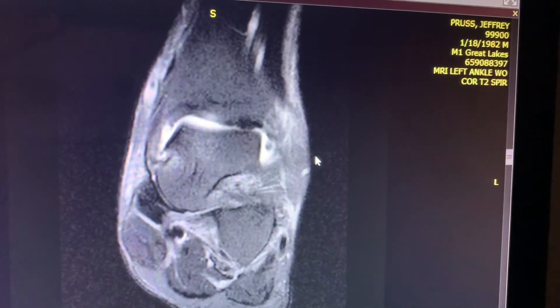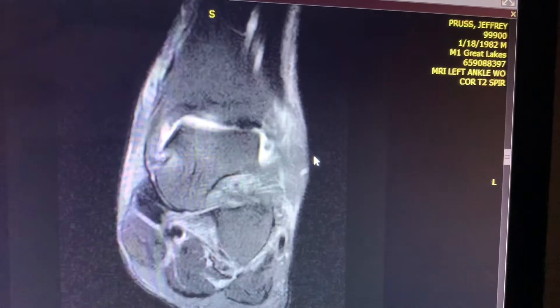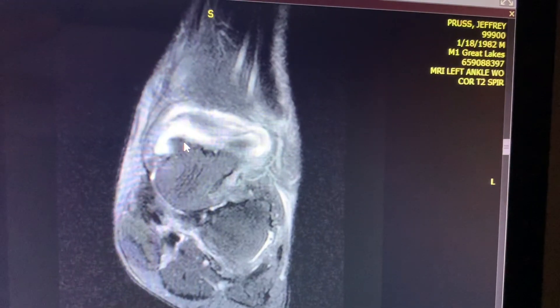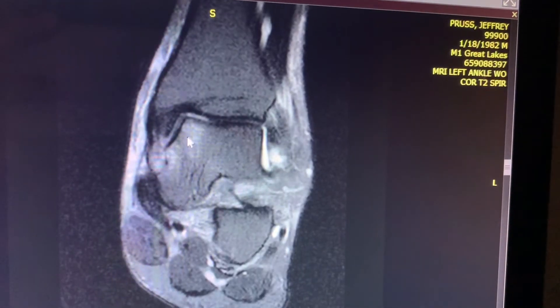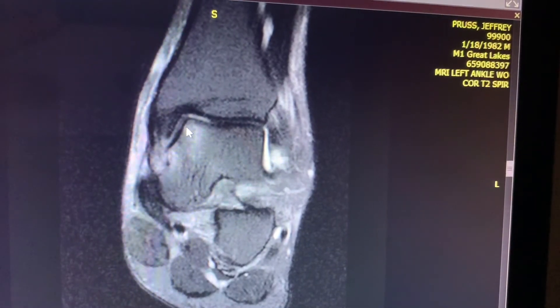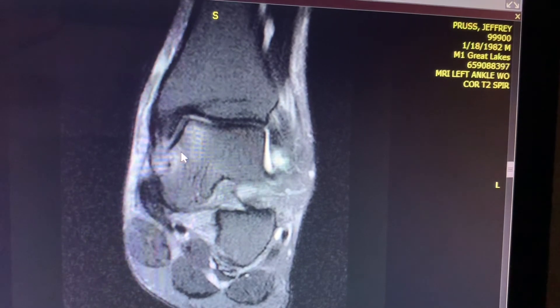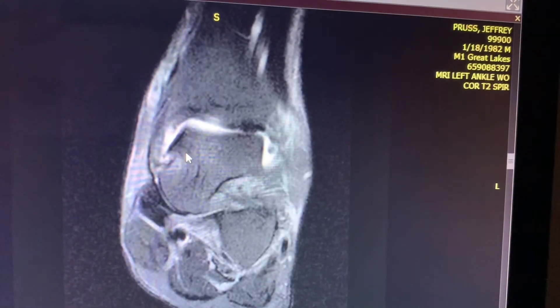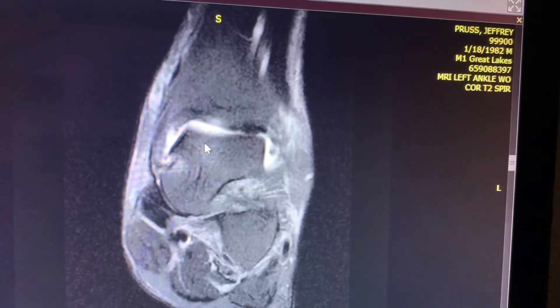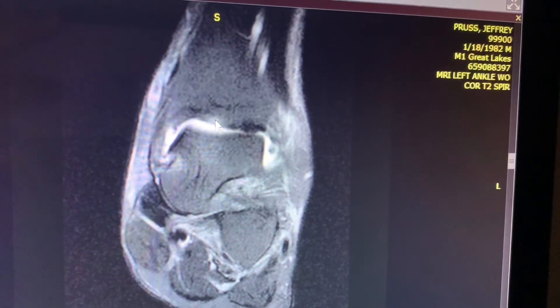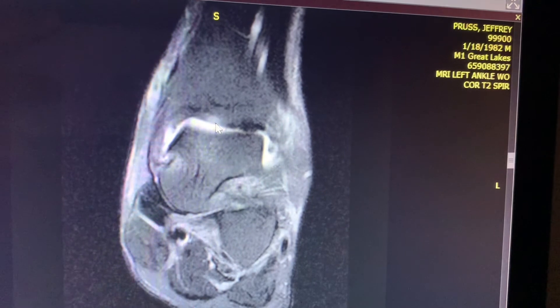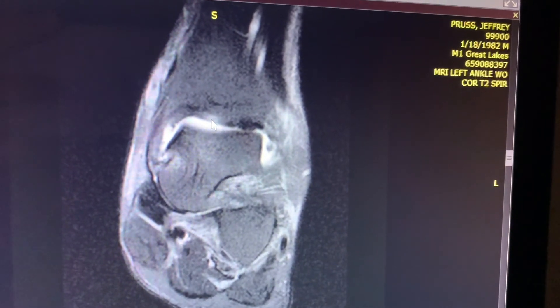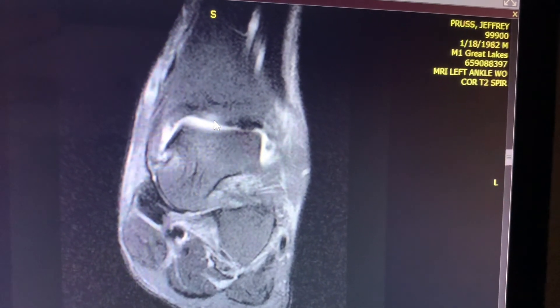This is causing some sort of impingement in the ankle joint, with resultant subchondral marrow edema involving the talus and tiny edema involving the medial end of the tibia.